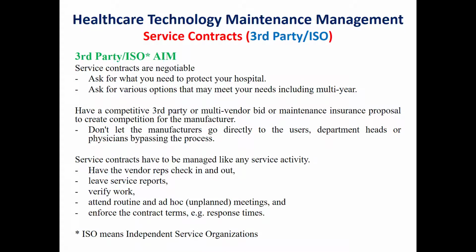The second type of service contract will be the third party or the independent service organization service contract. Sometimes it's better to have more than one choice in order to have a cost-effective solution concerning the maintenance cost for a clinical engineering department. In this case, a third party will be a good alternative.